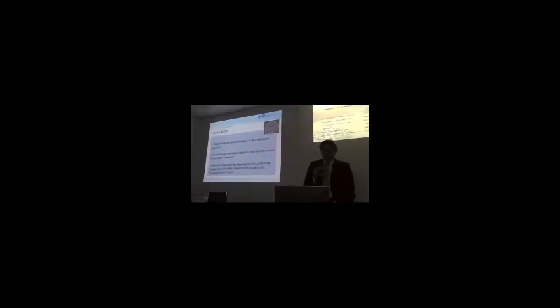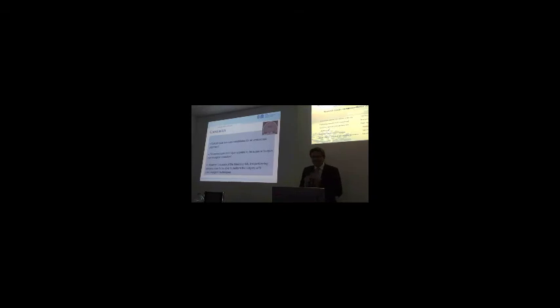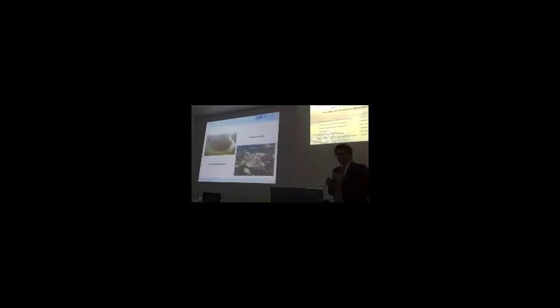So I think colloid cysts are good candidates for an endoscopic approach. I think it's quite difficult, an endoscopic approach. It has some advantages because I think preservation of the fornix is easier with the endoscope, and you have a nice view of the roof of the third ventricle. But there's a significant risk that you have to switch to the microscope, and I think it's quite difficult.